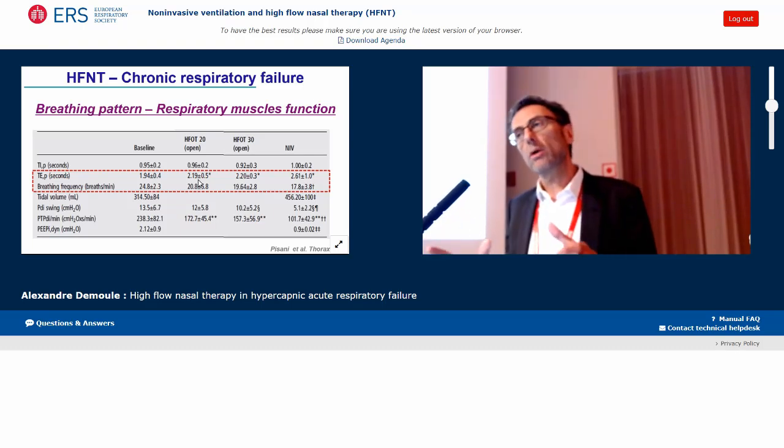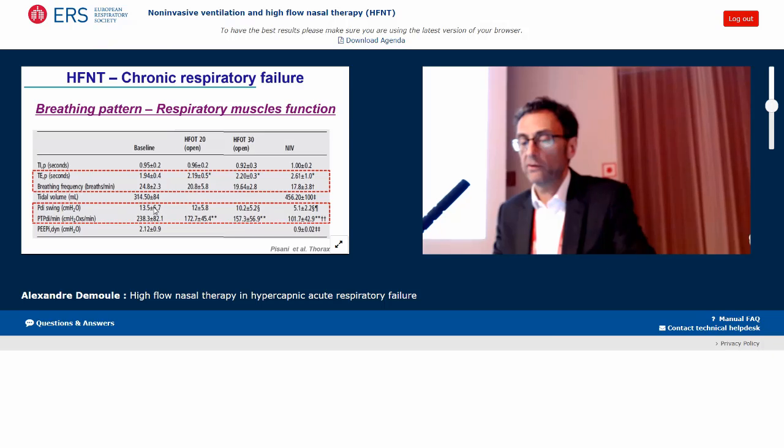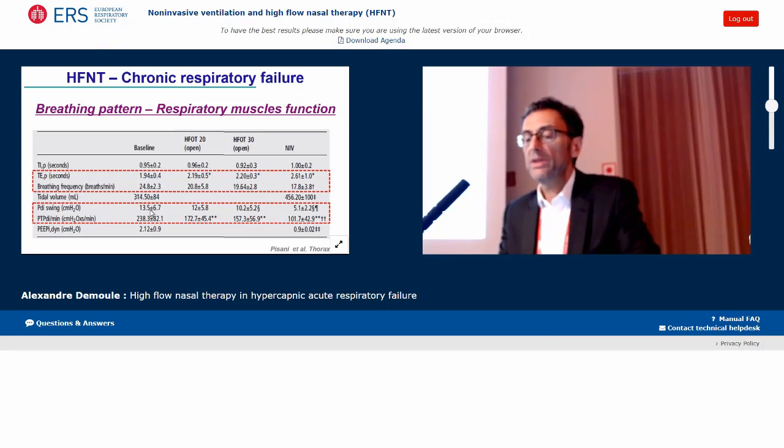It works less than non-invasive, but it works. And as a consequence, we can see that the PDI swing and the pressure time product of the diaphragm decrease here.